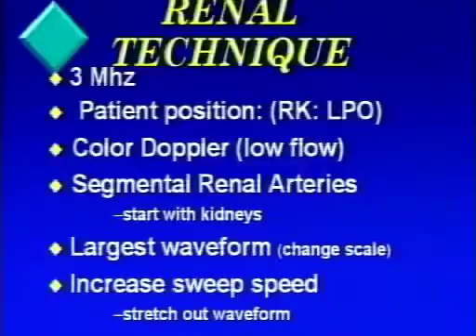Now, the technique for performing the examination for an indirect method would involve rolling the patient into an LPO position, placing the transducer directly over the kidney so that we have very little liver or spleen in view, depending upon which kidney that you're utilizing. The whole goal is to get the kidney as close to the transducer as possible so that we don't have to deal with effects of attenuation and we can get good Doppler signals.